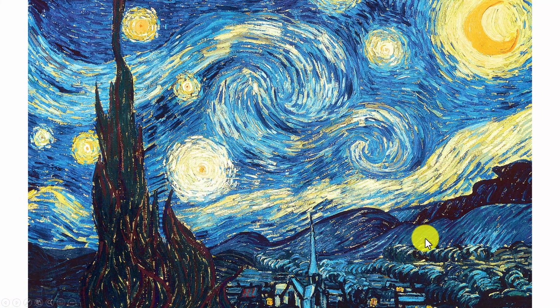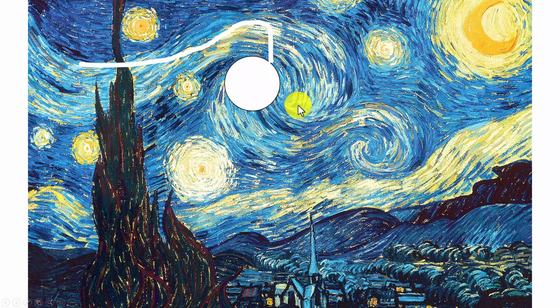And now I will induct you into the IgG4 Hall of Fame, which is right here in Boston, if you can identify storiform fibrosis in this Van Gogh painting. And indeed, I know I've inducted all of you right now, because right there in the center is the center of the cartwheel, and those are the radiating spokes of fibrosis.